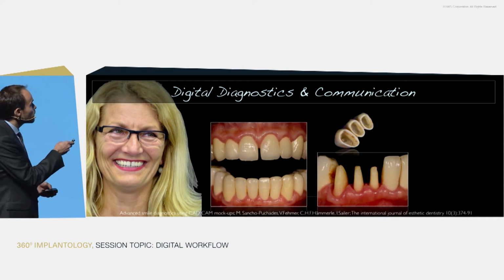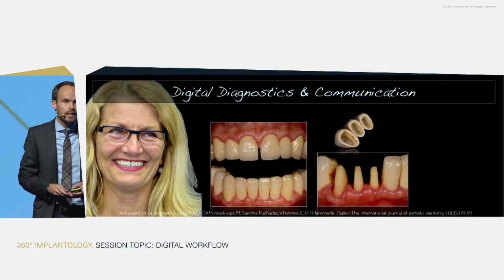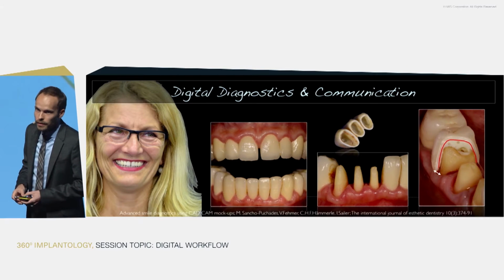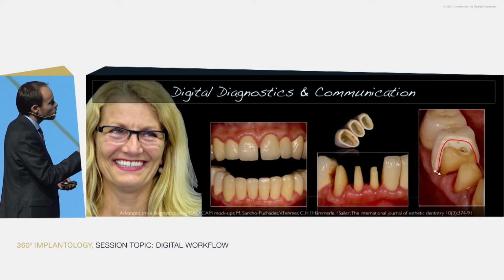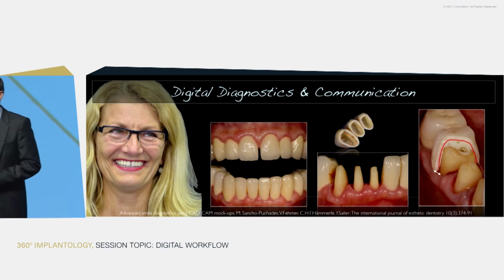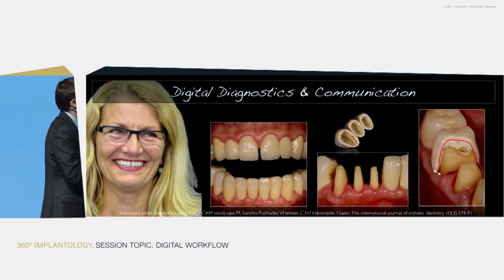For sure, with your eyes, you see the inflammation of the tissues, and you can see that besides the aesthetic aspects, there are more things to doubt about this case and to tell this lady at this early point. Once we look closer, you see this is the cement gap. It's hard to believe, and these are the offsets nearly on all of the crown margins. Having this case done in such a short term, maybe while she went on holiday for 2 weeks, comes with these kinds of limitations.